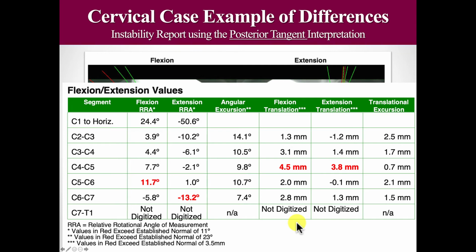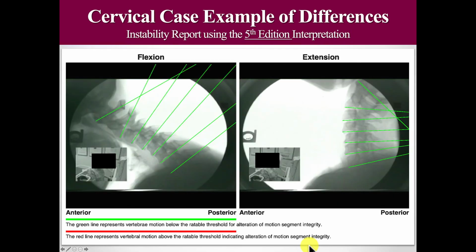And it's actually the true slope of the curve. Mathematically, this is the one that makes sense. Hopefully, in a future version of the guides, knowing that I know some of the researchers that are hopefully going to contribute to this, they will put this into the AMA Guides as a method of analysis. It only makes sense, especially since it's been documented in Spine as preferred over Cobb, at least in the sagittal plane curves, that it's superior. So why not use this for instability method of analysis too? And they'll probably correct it, making it not cumulative. This is where you get into problems.